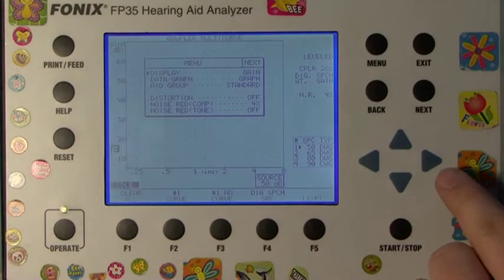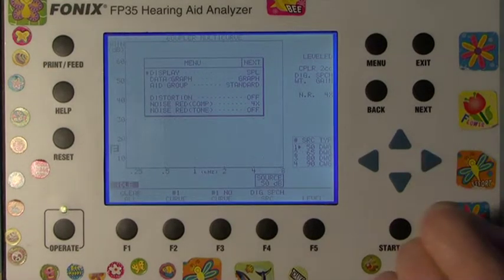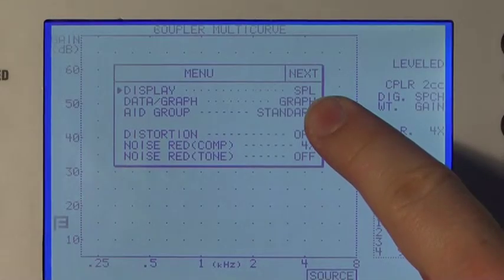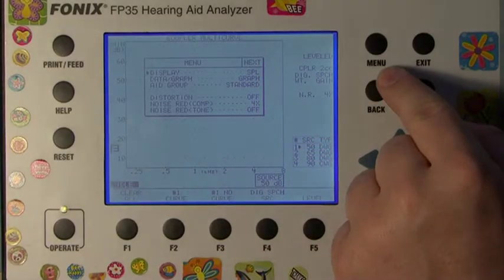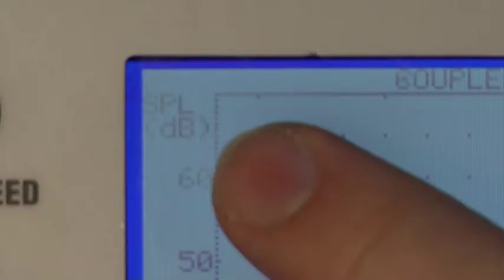Change the option on the row by pressing left or right arrow keys once. It now indicates on the small menu display SPL. Press the menu button to enter the changes on the screen. It now reads on the screen in the top left SPL.